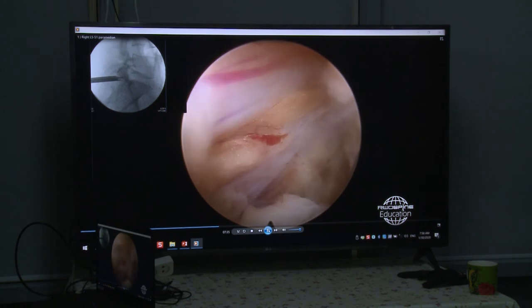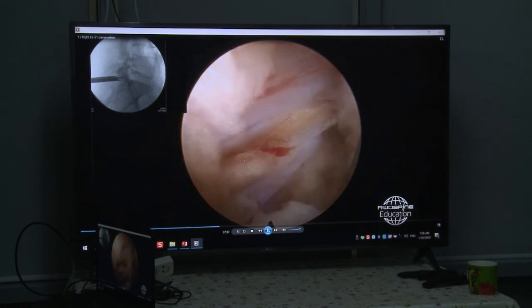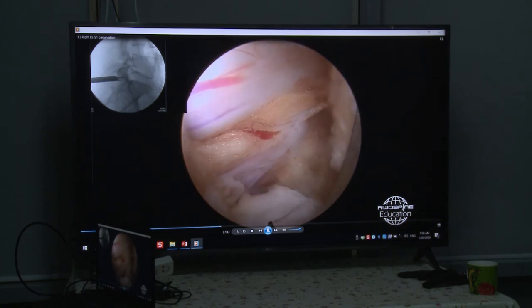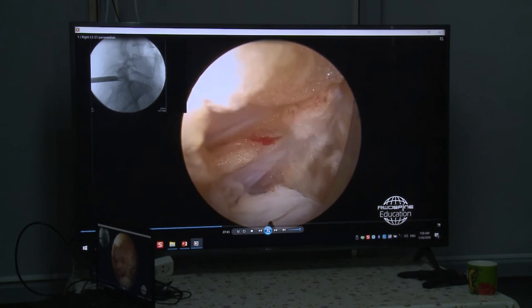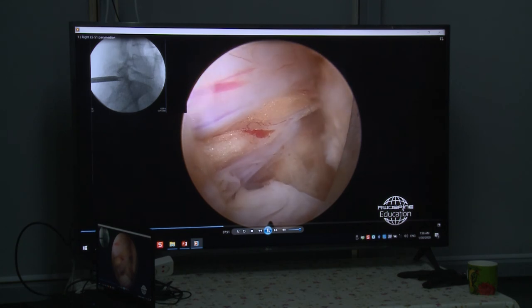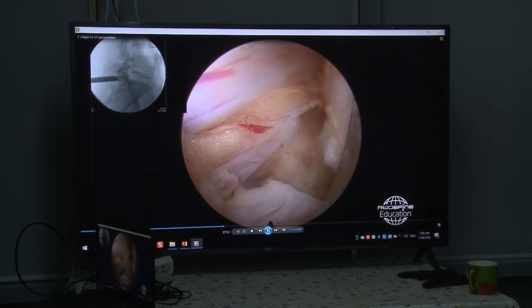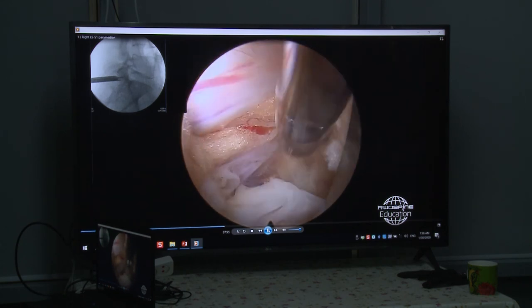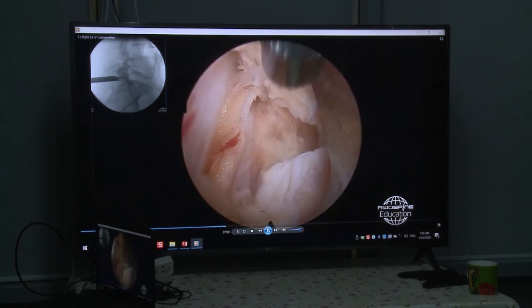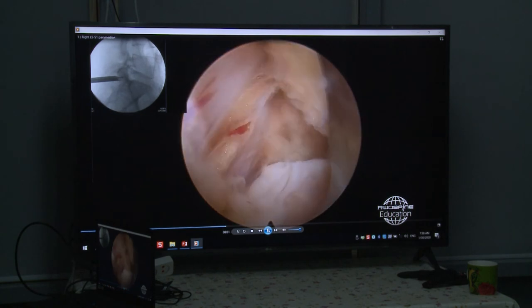So now, for example, I have here in front of me dura or something, yeah? But I don't know, is it the nerve root or is it the dura of the cauda equina? That means I do not know exactly. Do I work lateral of all neural structures, also of the traversing nerve root, or am I in the axilla and maybe the traversing nerve root is here lateral? In this case, we see everything, but in a lot of other cases.